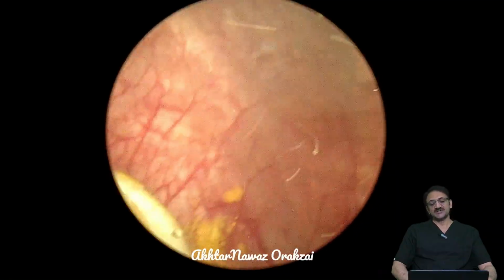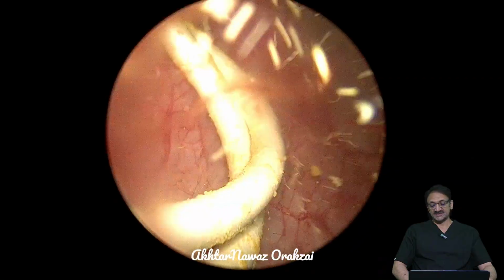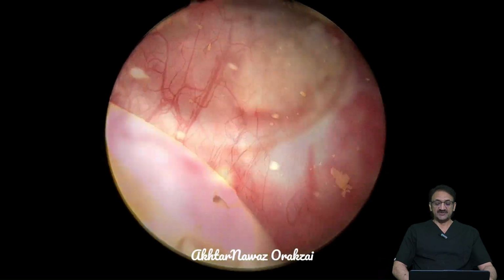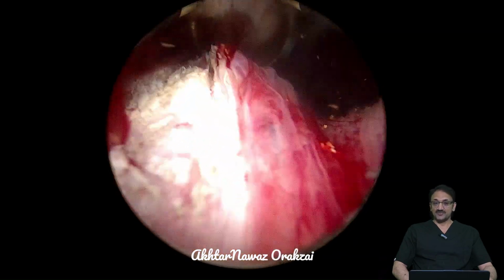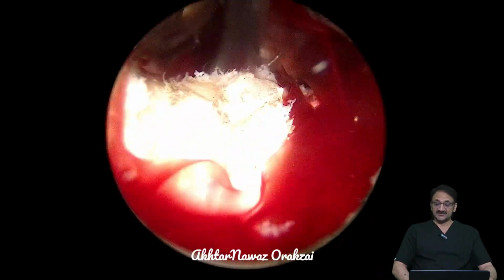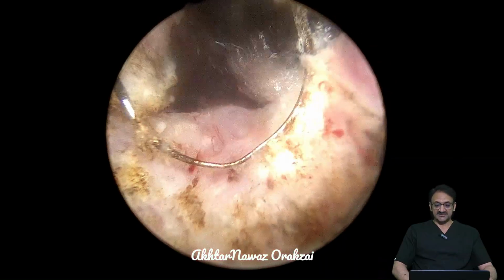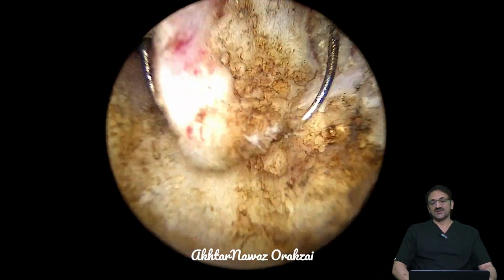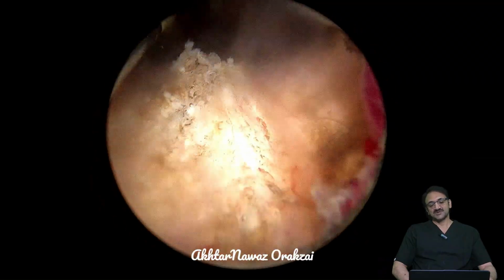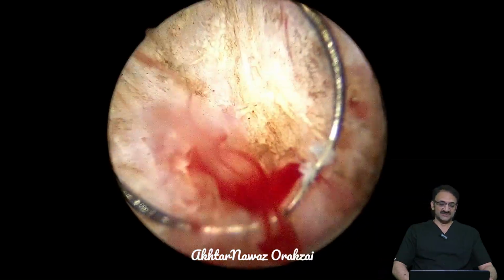Here you can see the median lobe, and the patient is 62 years old, and there is a stent placed in him. The reason for the stent was the right-sided percutaneous nephrolithotomy performed 4 weeks back. During the cystoscopy and ureteric catheterization, we found that the patient had a median lobe, so he needed a resection. So we decided and planned that after the PCNL, when we are performing removal of the DJ stent, we will also perform a transurethral resection of the prostate.